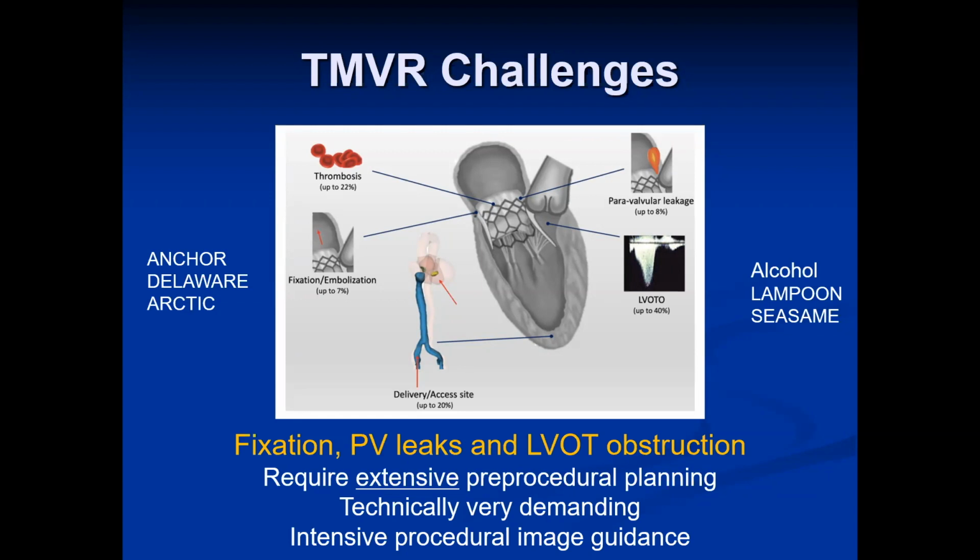And the incidence of atrial fibrillation in patients that we do mitral valve surgery on in the postoperative period is 30%. And how many patients develop late atrial fibrillation? So I can do it with a $40 suture in 2 minutes or put a clip on in 1 minute. And why would we not do that rather than send somebody very late to the cath lab for a left atrial occlusion device?